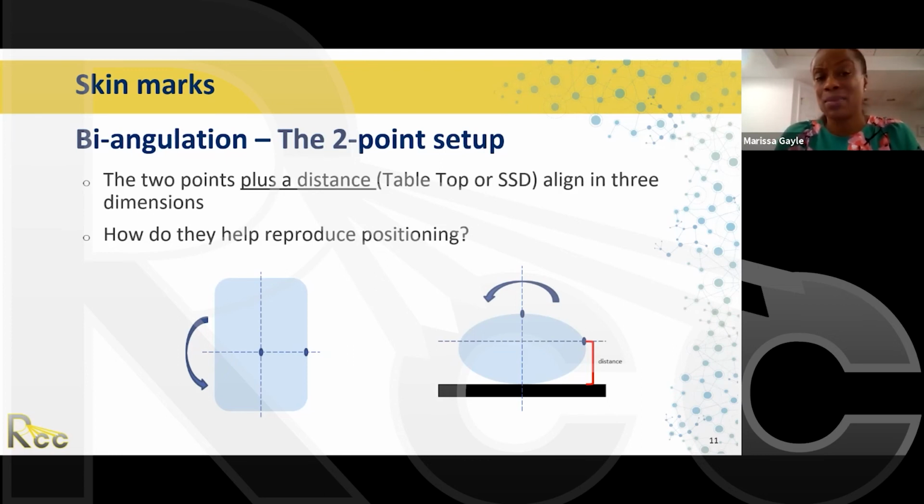It could be done at the time of the sim, or it could be done after the plan has been created. I don't think either is wrong. It just depends on what they see on the CAT scan and what they deem to be a better and optimal treatment for the patient.